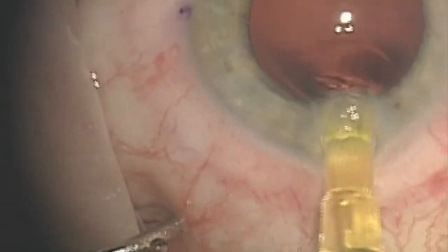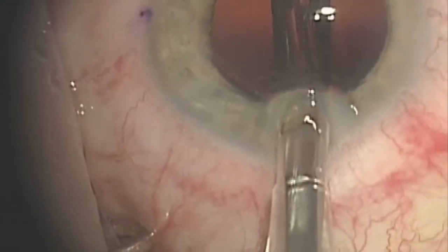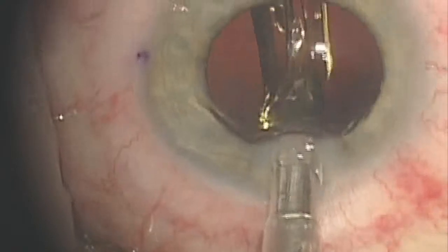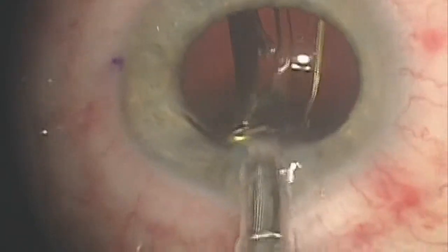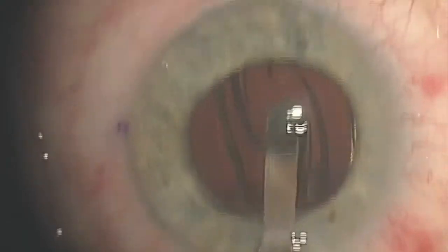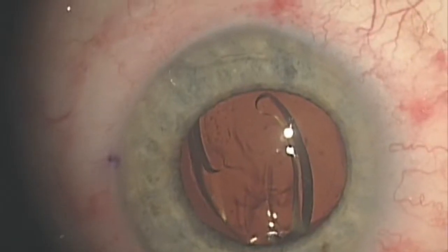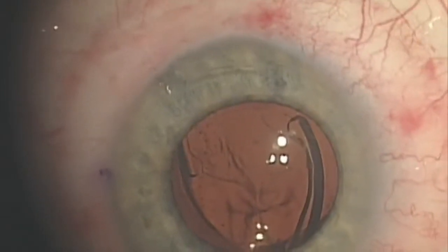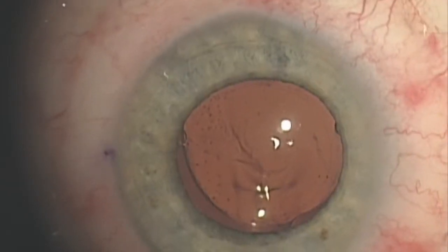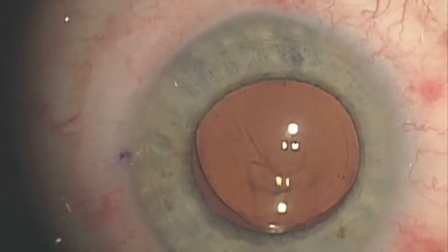So when we go through here, this injector is got to be, there we go. See how beautiful it is? It goes in like a little cigar. Look at that. Now they also have auto injectors we can use with this machine. They're pretty fun. They kind of just squirt it in there. It's not hooked up right now, but we can do that. Again, technology. Now if you look at this lens, the really fun thing about this multifocal lens is it looks like a frisbee with all kinds of different rings.